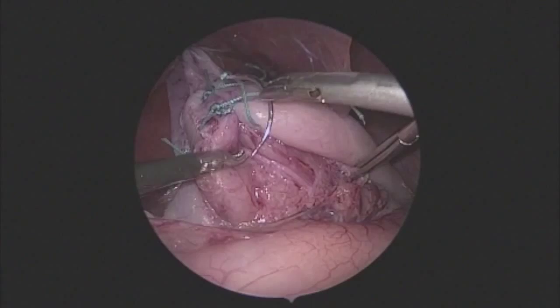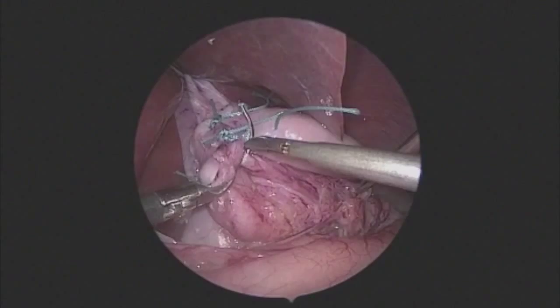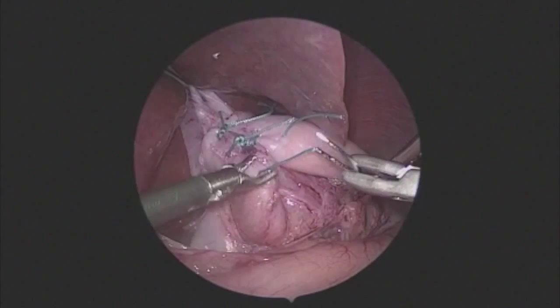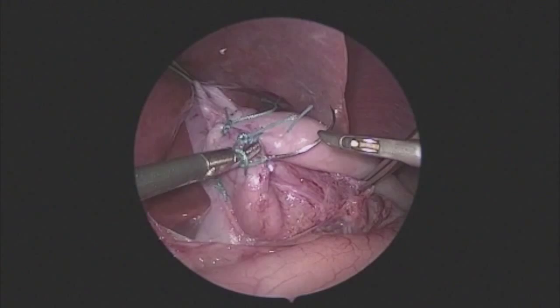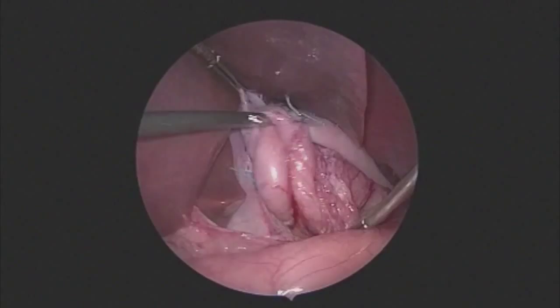This procedure in real time took 20 minutes and has been edited down to about half of that. This is a very straightforward and easy procedure. The use of a right-handed three millimeter sealer allows for excellent dissection, limited instrument changes, and very safe use of heat energy. The completed wrap is not too tight, sits well above the GE junction, and is nicely positioned at the 11 o'clock position.